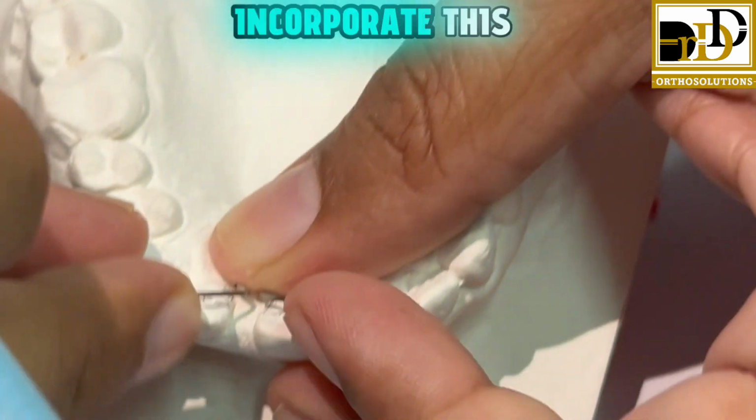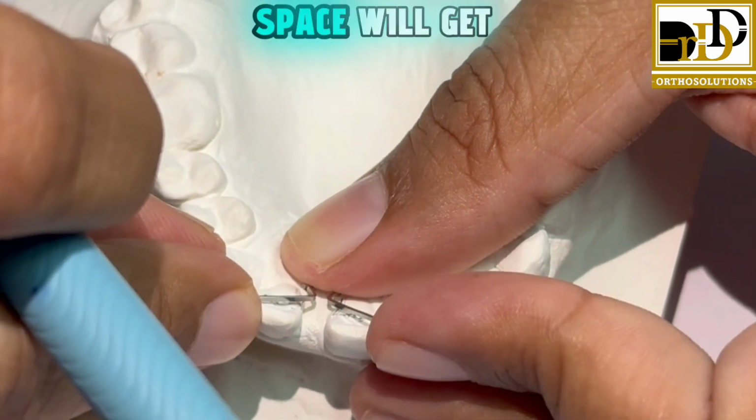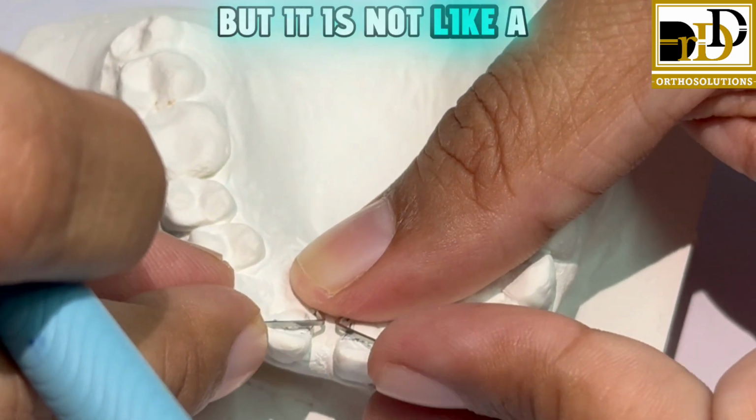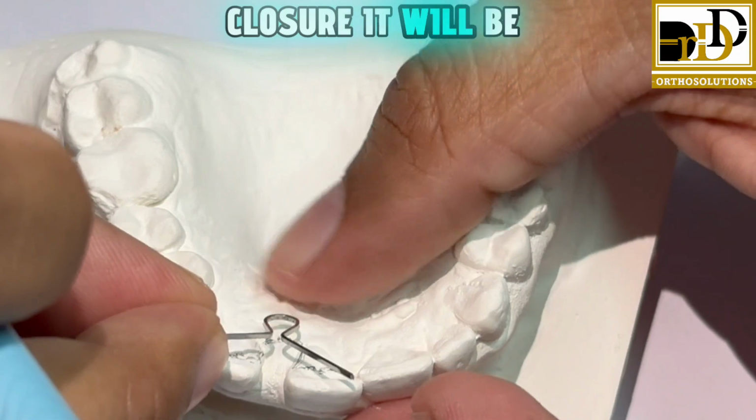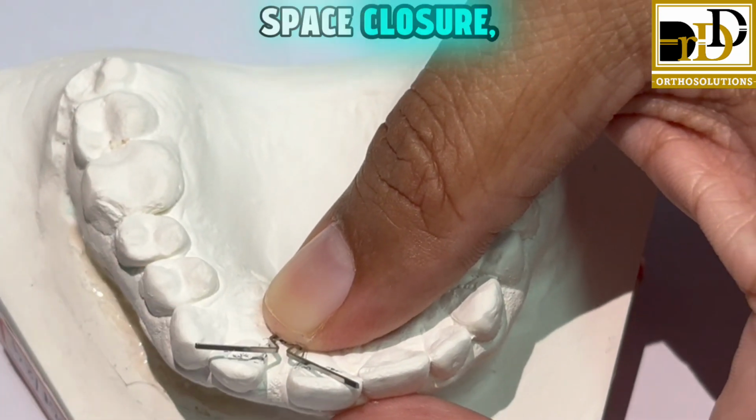So when we incorporate this into the brackets, automatically the space will get closed, but it is not like a bodily space closure. It will be like a mesial tip type of space closure.